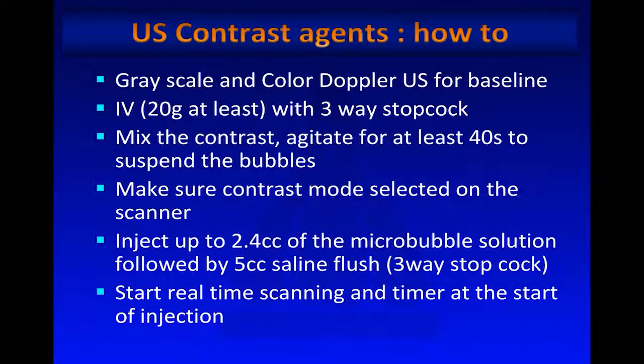So how do we do it? Well, the first thing you need to do is to have a good grayscale and potentially color Doppler ultrasound for baseline. You need the patient to have an IV, and this is, again, impacting your workflow because most patients for ultrasound will not have an IV, so you need an IV.